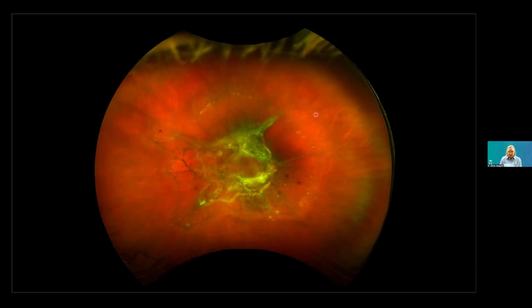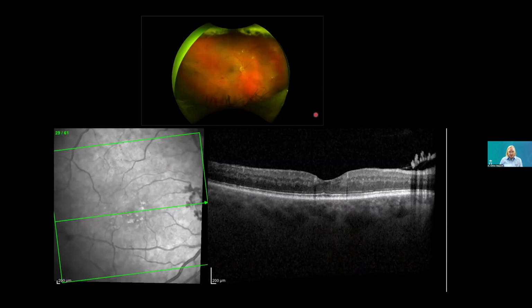So this was an uninsured patient. They had been told to go to retina the year before, but they told me during this exam that they just didn't understand or think they were going to go blind. And so at this point, I just wanted to really let the patient know, you have to be able to save your right eye. And so we used OCT to really go through the scans, show him how this neovascularization is starting to tug on the retina and why he needs to go and get this treated.